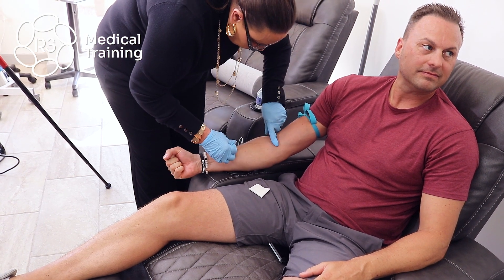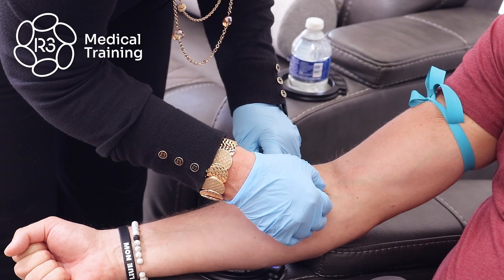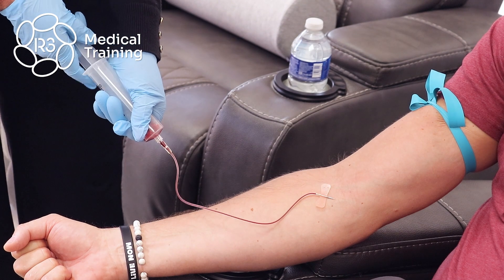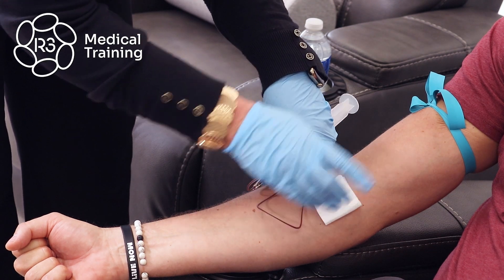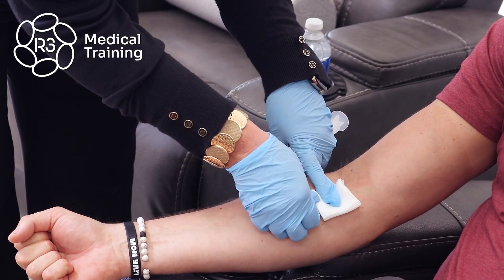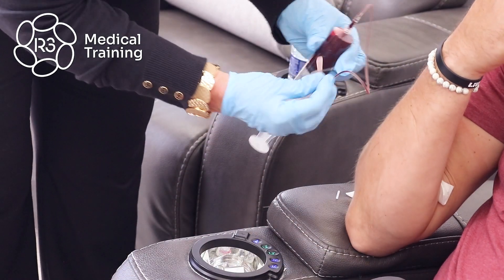Make a fist for me. Draw out 30 cc. Perfect. Release the tourniquet. Remove the needle. Place it in your arm and apply pressure and hold that for two minutes please.